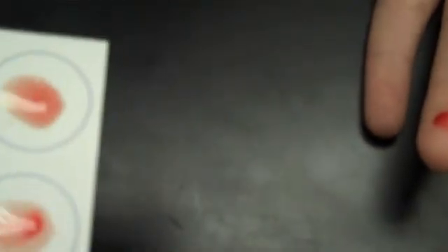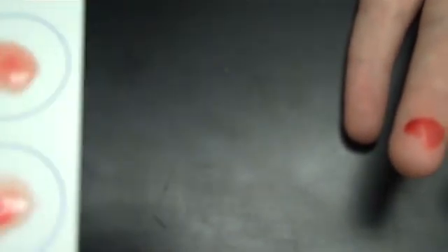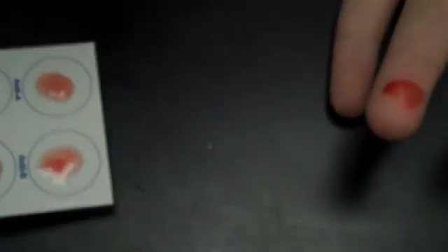Let's look at yours. What blood type are you? You positive? Does it look like the anti-D is clumping? It doesn't really look like the anti-D is clumping — it just looks like it's coagulating. Your blood dries anyway, so that just looks like normal drying and coagulation. Notice how it's all dotty in the B zone, which makes me think it's B. But that's definitely a false positive then. We got the procedure down.